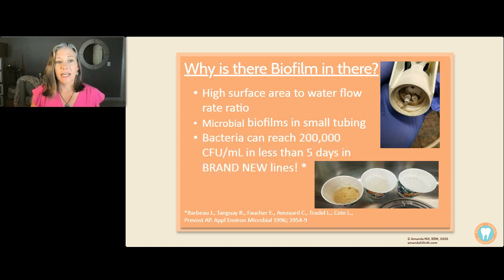This is a fascinating study that Barbeau and group did back in 1996. 1996, right? I mean, we should have been knowing about this for a long time. They took brand new dental unit water lines. So a brand new office just got built, spanking new lines. And in 5 days, so we're talking Monday to Friday. I don't actually know if those were the days, but Monday to Friday, we'll say. By Friday, the CFUs, the colony forming units, the biofilm in those lines had already reached 200,000 colony forming units, and safe drinking water is 500 colony forming units. And that was in 5 days in brand new lines.